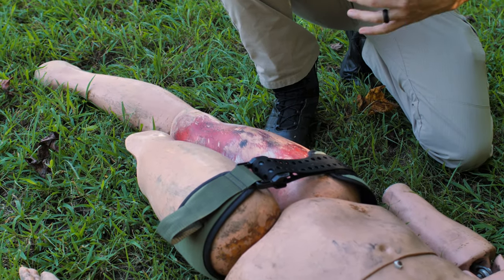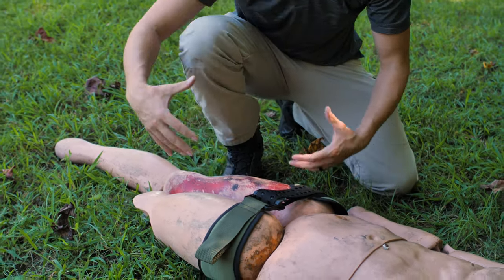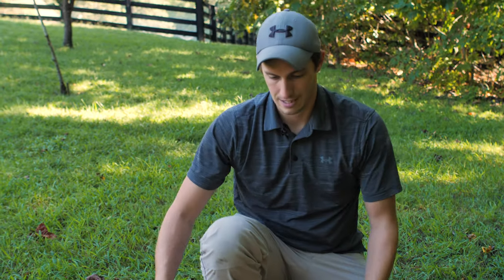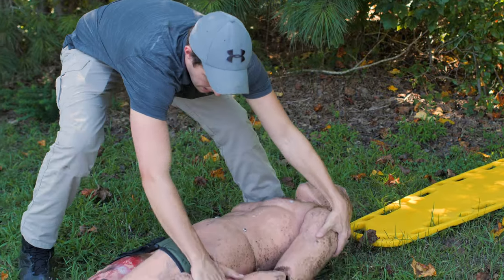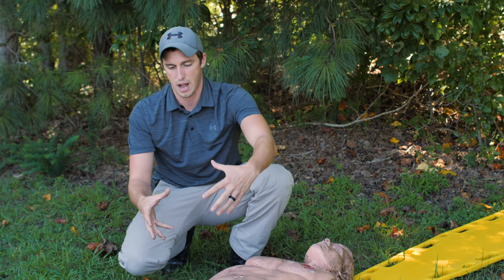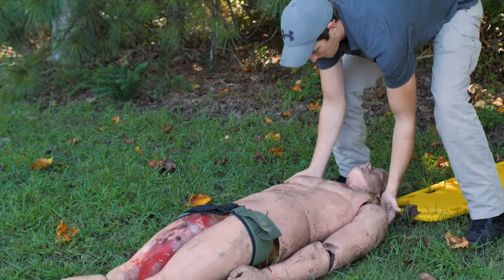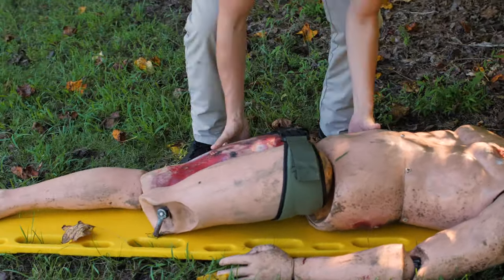The last thing we want to do is put this patient on a long spine board, which will keep them in line and keep their legs from moving. If the pelvis is stabilized but legs can still move, it will put unwanted pressure on the pelvis. The typical way to get someone on a spine board is to log roll them — roll them up, slide the board behind them, lay them back. However, with a pelvic fracture we're manipulating the pelvis significantly when we roll. It may be better to pull them lengthwise straight onto the spine board, gently lifting or dragging to keep everything in line.